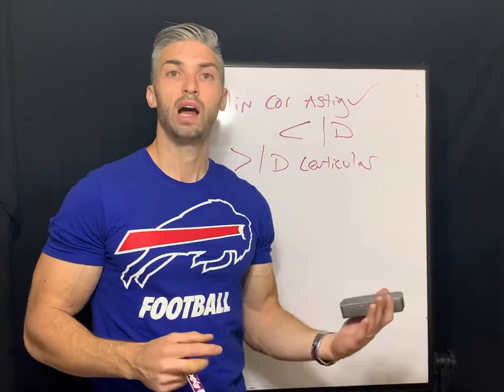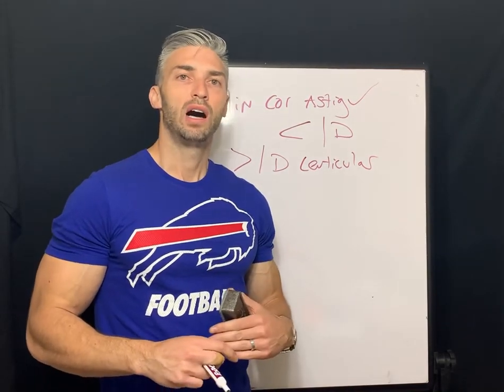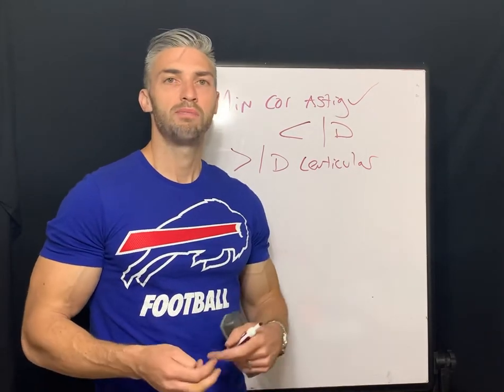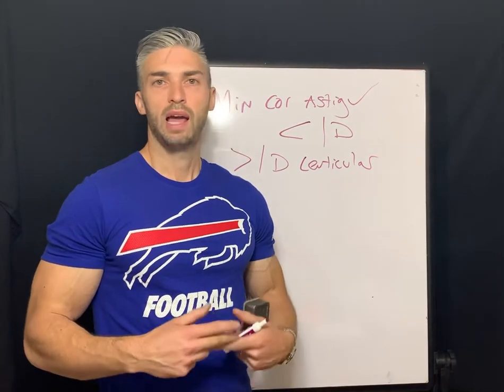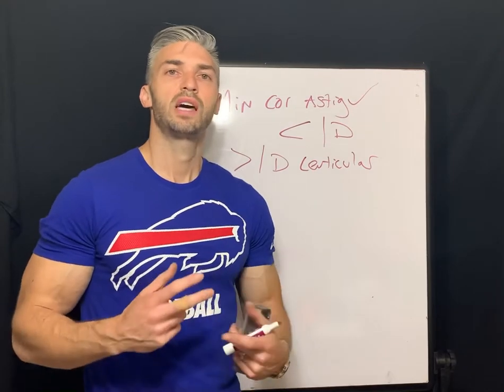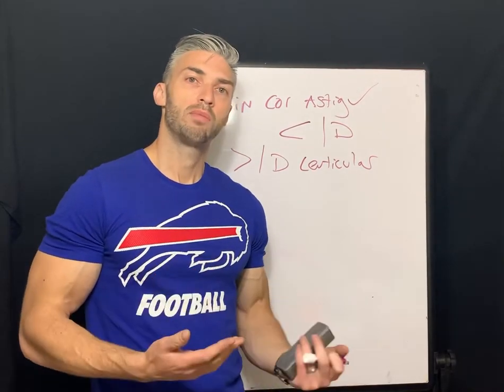It's 43 diopters of strength. And then you have the crystalline lens, which is inside the eye, and that's about 17 diopters of strength. But either one of those lenses can possess astigmatism, cannot be completely spherical, and you can have subluxation of the lens, different things inside the eye that can create astigmatism that wouldn't show in a keratometer reading, right?